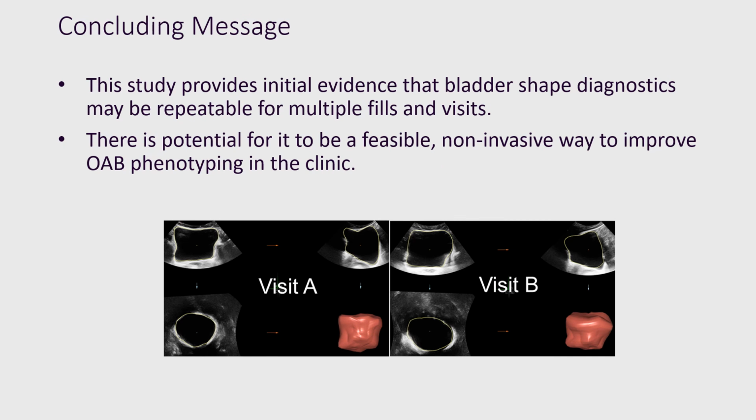In conclusion, our study provides evidence that bladder shape diagnostics may be repeatable across multiple fills and visits. As such, there is potential for it to be a non-invasive means to improve overactive bladder phenotyping in the clinic.